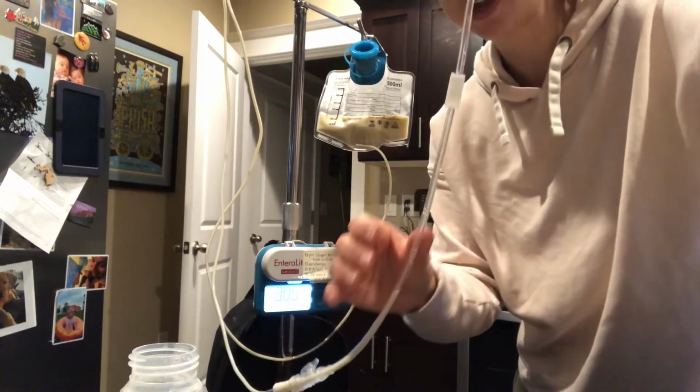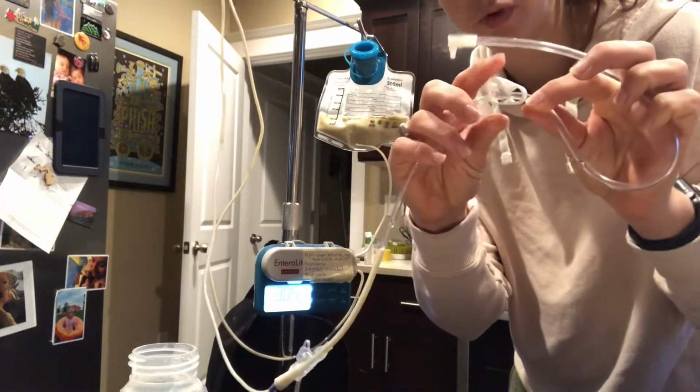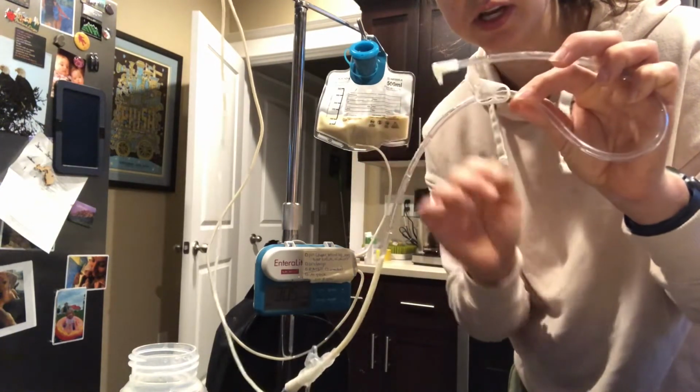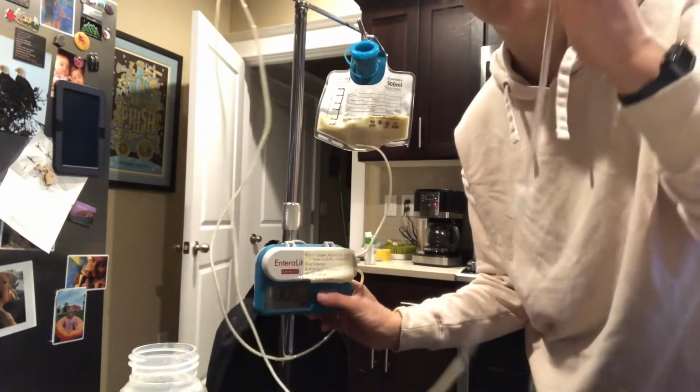The other thing, sorry, I should have mentioned, is that there's the clamp on the tube. This will stop any liquid from going in or out. So if it is clamped, you just always make sure that it's unclamped and prime it. Otherwise, you'll push the prime button and it won't work.